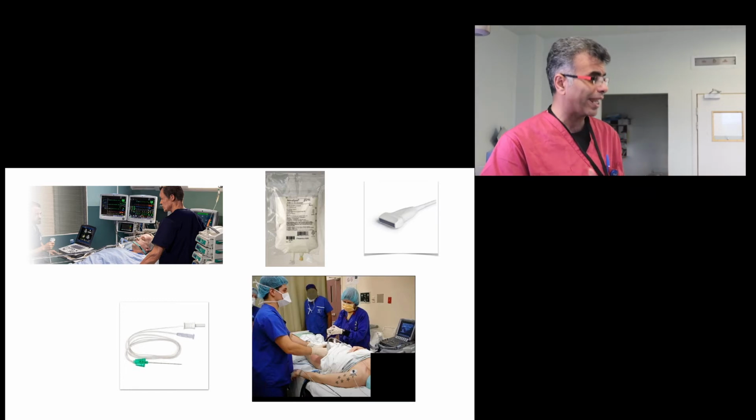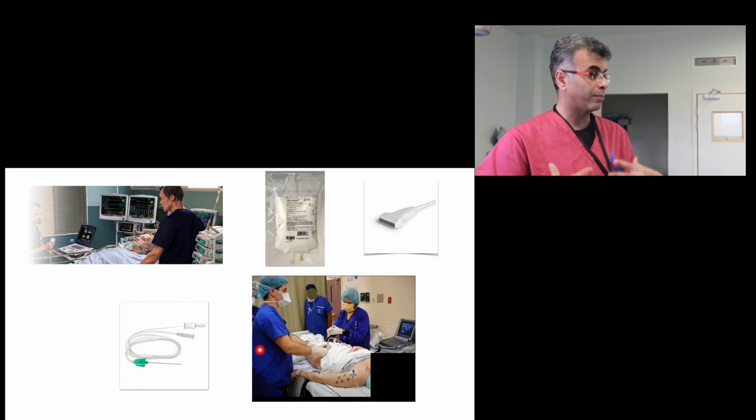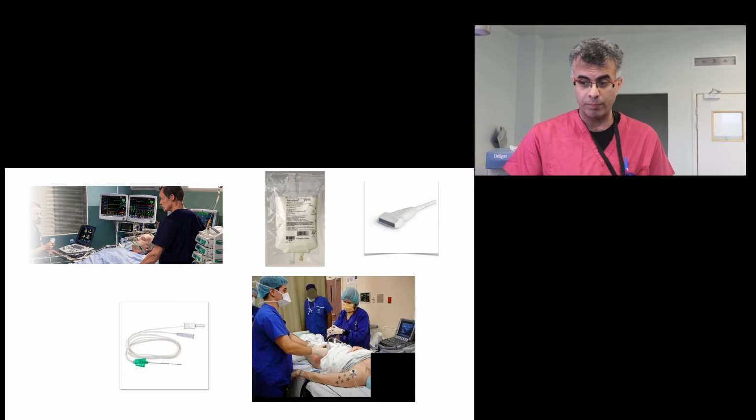When you're doing any block, it's very important to do it while you are in an easy position for yourself, to do an easy and safe technique without being tired. So if you have a sore back and you're doing this block and you're not happy about the position, you will be tired and you will lose all your technical skills when you're doing the block.